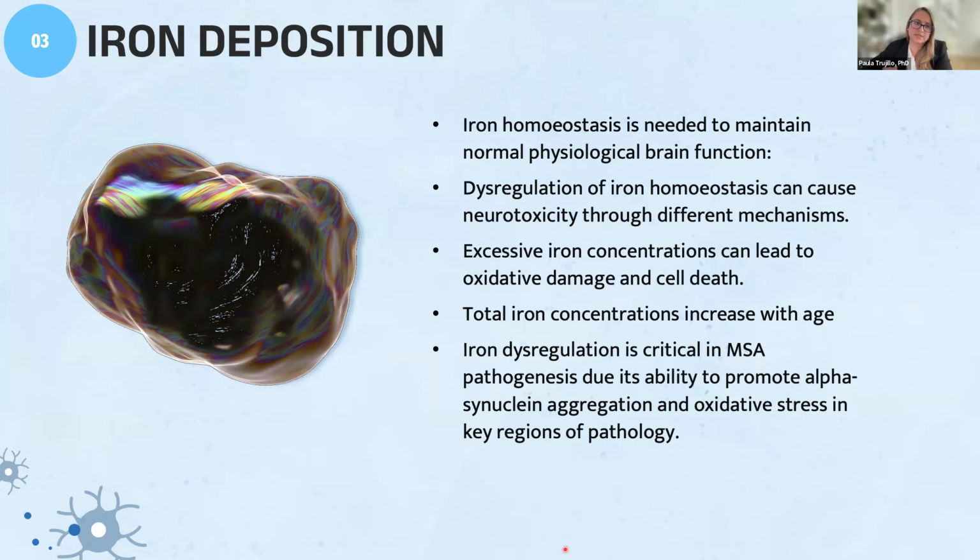Another important quantitative imaging method are those that are sensitive to iron deposition.